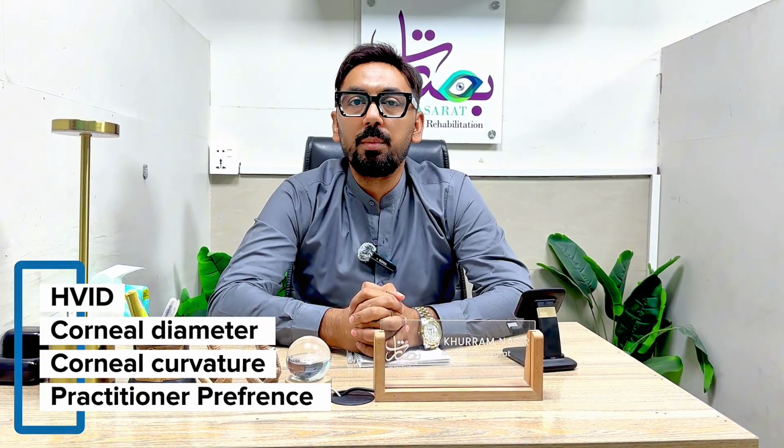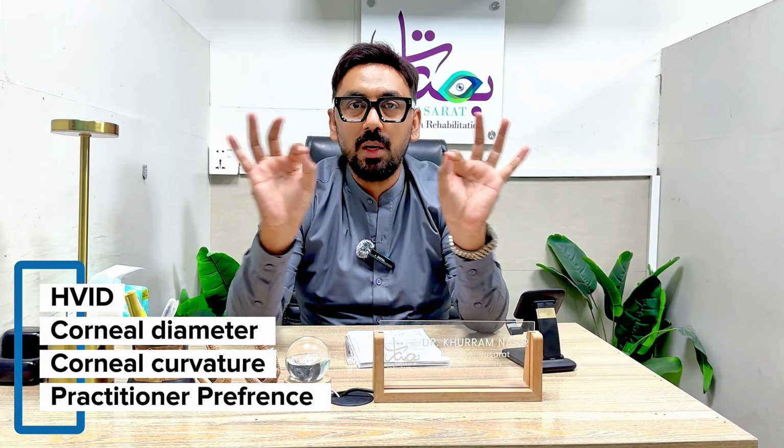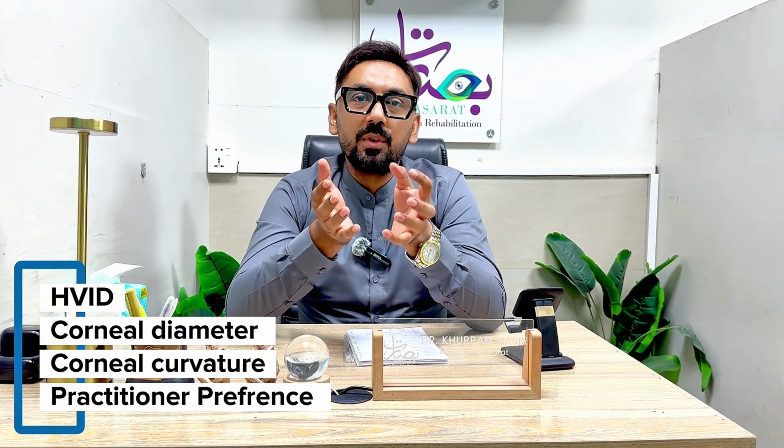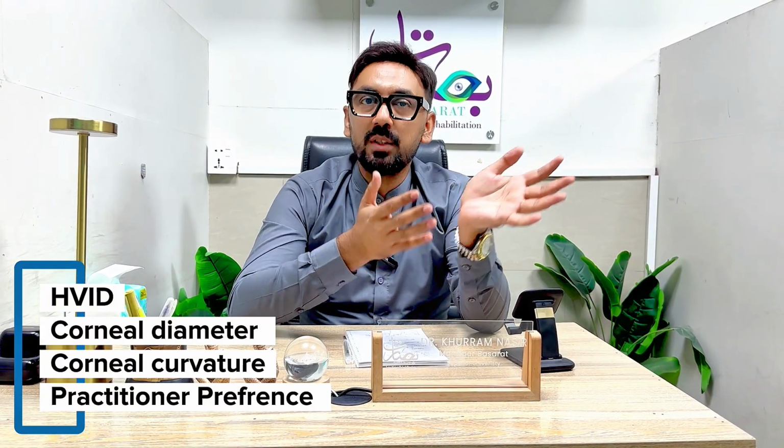So this is how we can find the base curve: the initial base curve with the help of the keratometry, and the final base curve with the help of the fluorescein pattern. Now the next very important parameter is called the TD, the total diameter of the RGP lenses. And how can we find that? We can easily find the total diameter with the help of the HVID, the horizontal visible iris diameter, the corneal curvature, and the practitioner's preference or the patient's need, right?